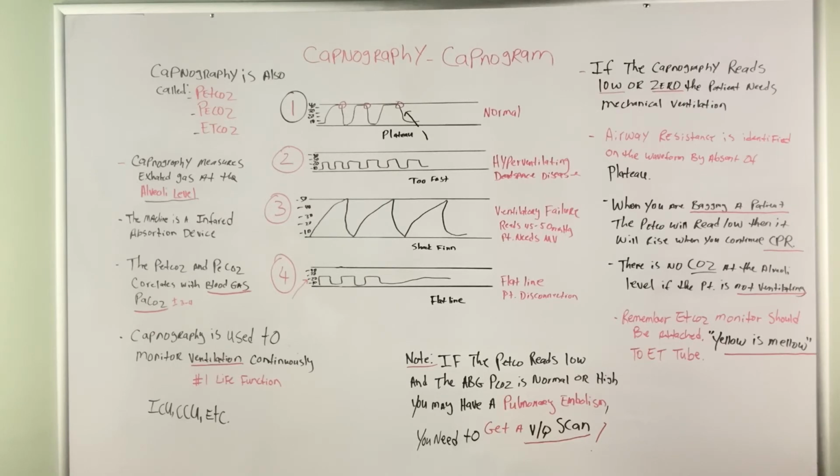Capnography is used to monitor ventilation continuously. You should never forget that, because ventilation is our number 1 life function. Now, you don't see these machines on the medical floor. You're going to see these machines in the ICU or CCU.